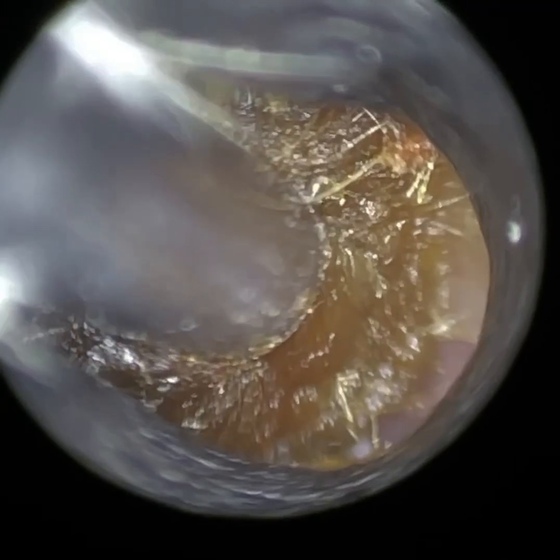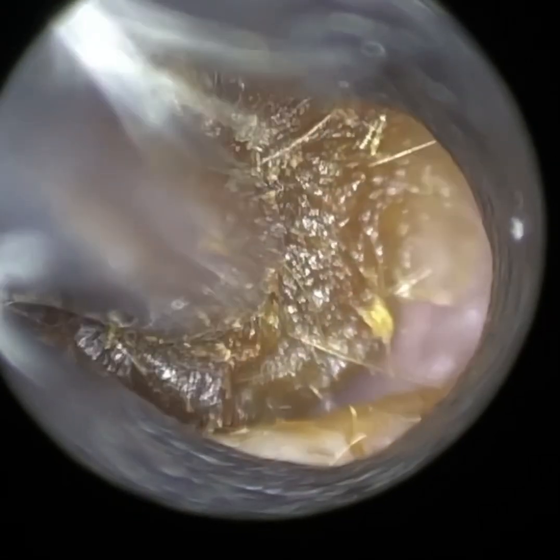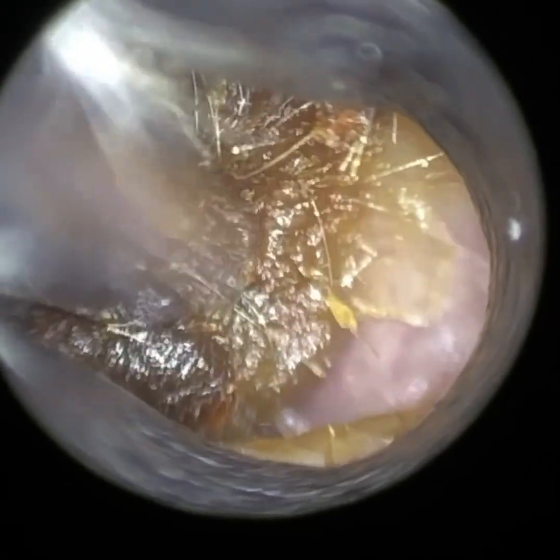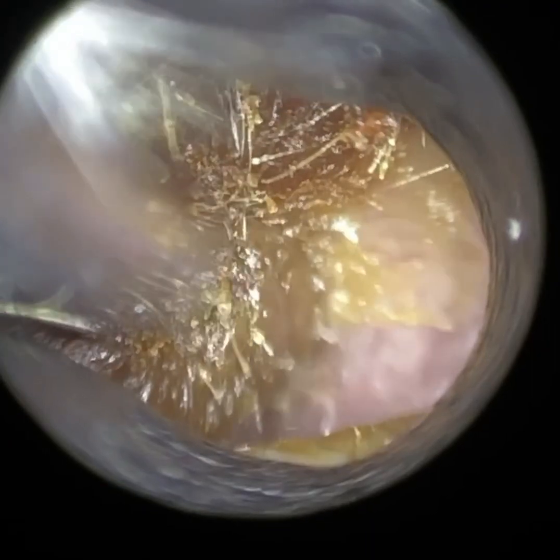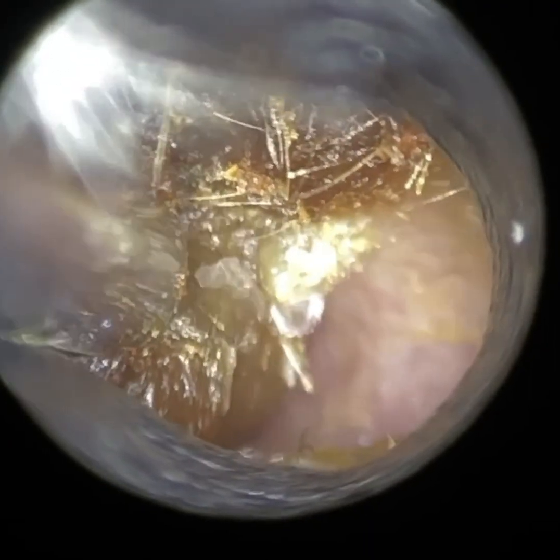Over the last seven years, when we've been providing training in ear wax removal using our Clearwax iClearScope endoscope, one of the primary reasons why delegates attend the training course is because they really, really struggle with narrow and bendy ear canals.